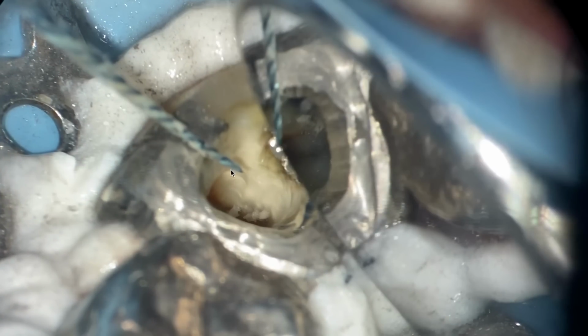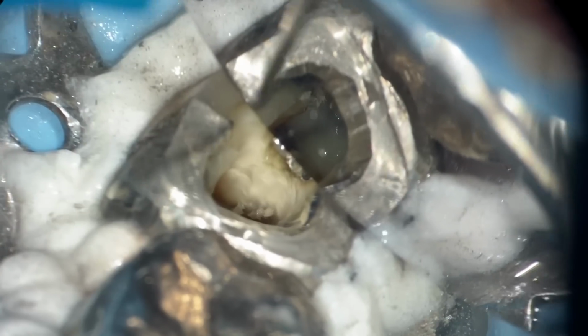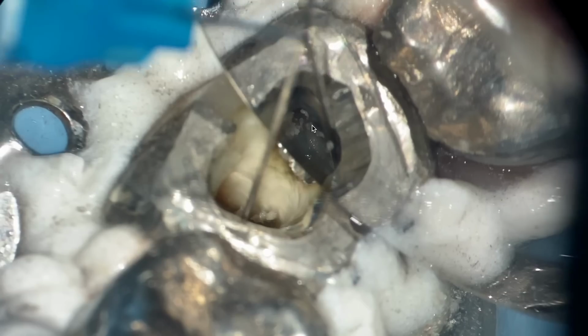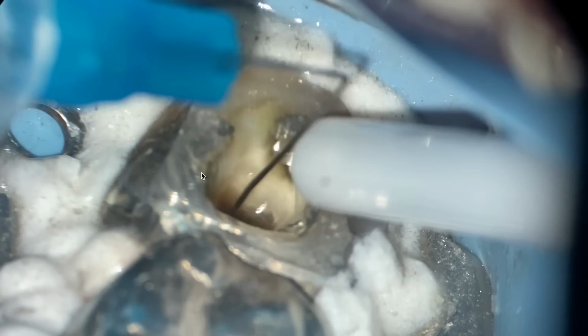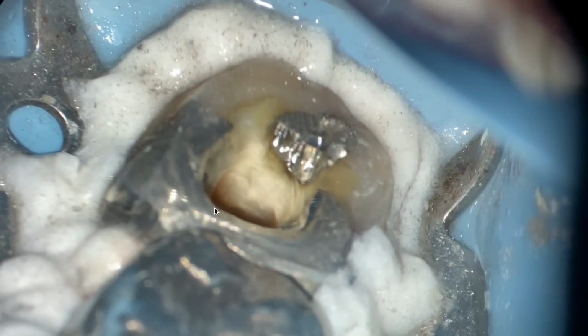When I stop my file, I'm looking to make sure it's not broken. You can see all the debris that's cutting, and now I've got that opened. Boom, that's it. So what might be really helpful, now that you've confirmed that the canal is there, I'm going to irrigate that out, but what you could do is take that endo Z burr or a diamond and remove even more of this amalgam here to make your life a little bit easier, because what you're going to experience, as I've done many times, is your apex locator is going to be ringing like crazy.